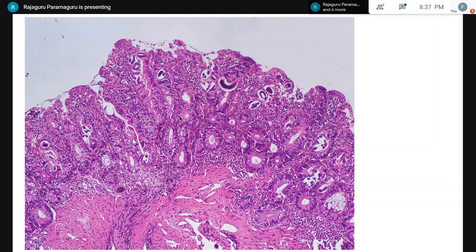That case we've crossed, and that is Strongyloides stercoralis. Dr. Nusrat Sayed says strongyloides. Let's go ahead. So this is the next case.